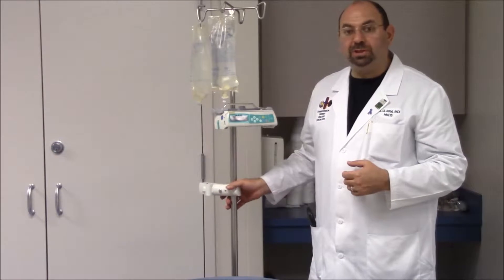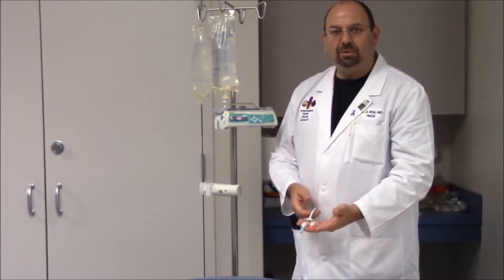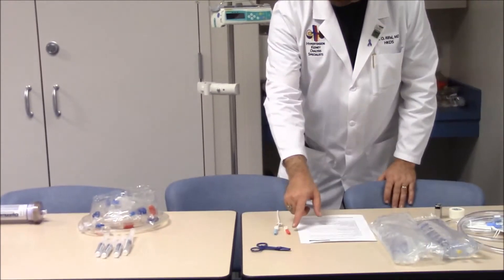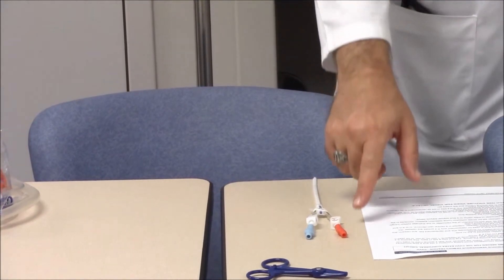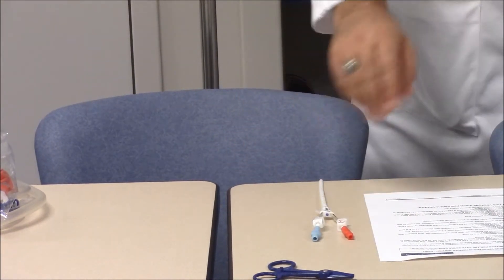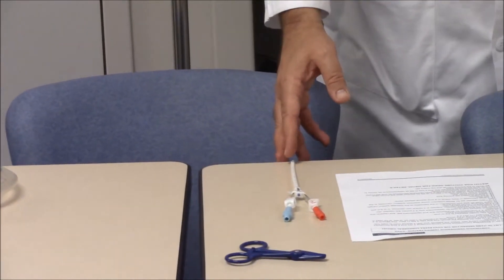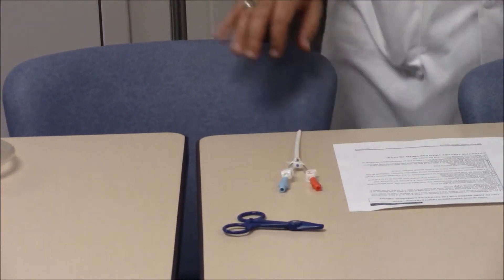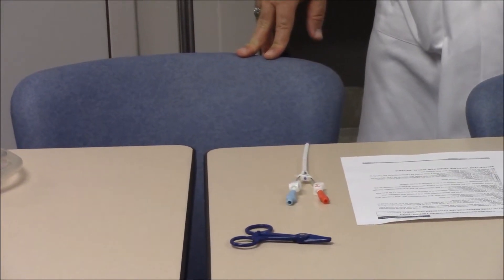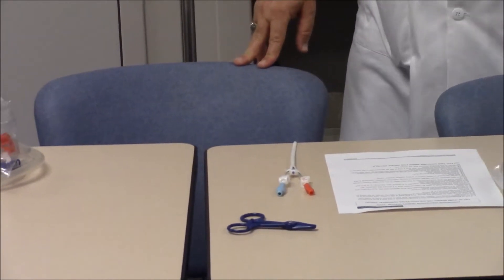Another essential item is the hemodialysis catheter. It has two ends — an arterial end (red) where blood is drawn from the patient, and a venous end where blood is returned. Both ends are intravenous; there is no arterial stick — it is a single stick into the vein using a double-lumen dialysis catheter. Preferably it is inserted in the femoral vein or the right internal jugular vein. Insertion in the left internal jugular or subclavian veins is totally discouraged.